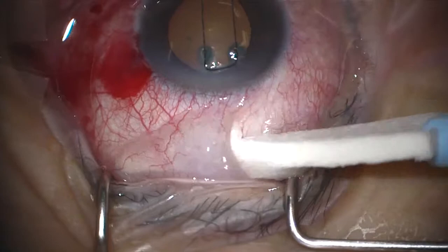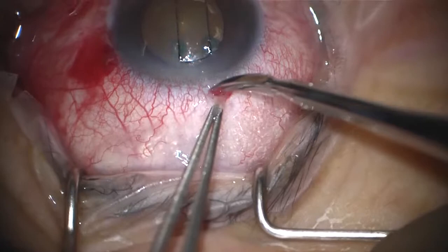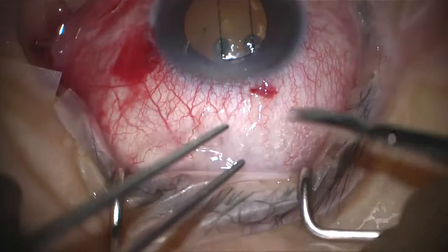So this is just the mitomycin again. Every time you touch the conjunctiva, we want plain forceps. And you can see I'm making my incision with the Vannas scissors tangential to the limbus, so I don't have any radial incisions.